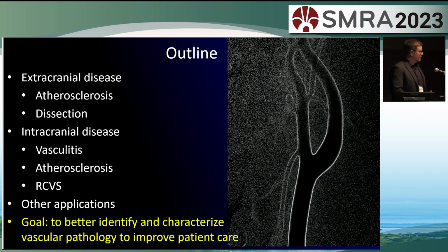I will put some data in this talk, but the images from the patients that you see are the ones that in particular change the mind of neurologists and neurosurgeons in the use of vessel wall imaging.